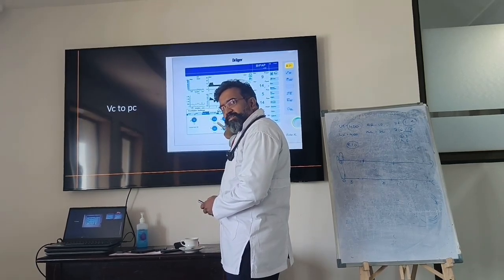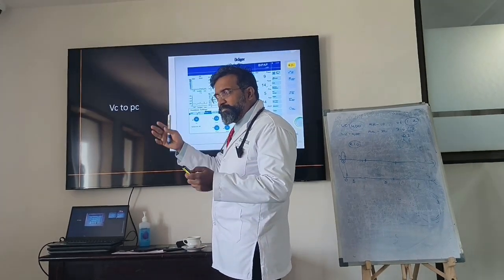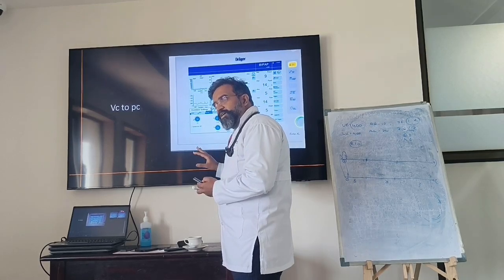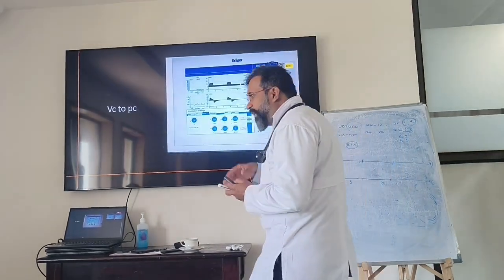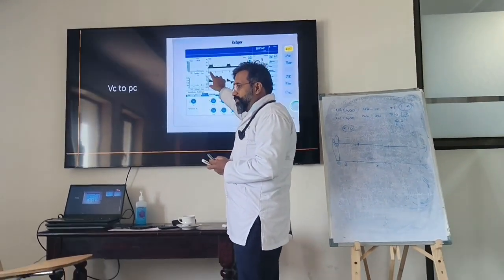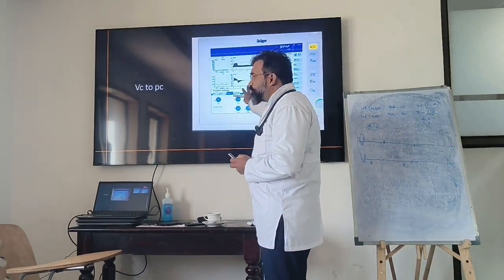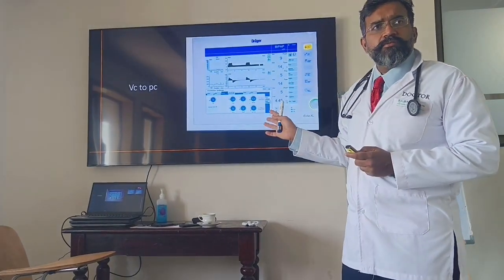Samajh mein aa raha hai? That is how we differentiate them, on the graphic analysis, that's how we explain. But if you go to a practical model, you will not get RR. Clear on this? And moreover, the breath type. What is the breath type? Constant pressure, triggered by the patient or triggered by the machine, flow cycle. Volumes are not shown. The volume would be the clincher for pressure support. Clear on this till now?